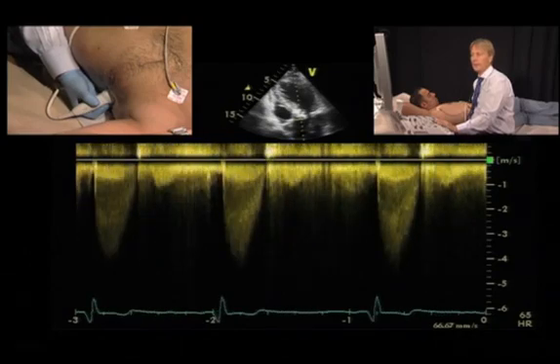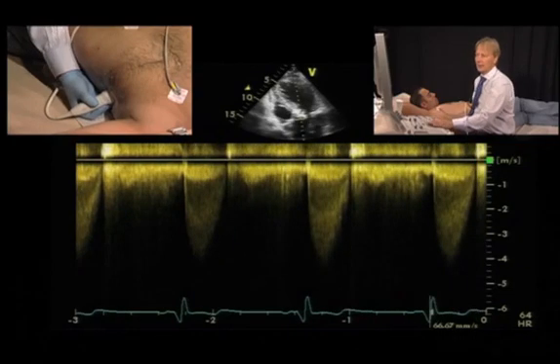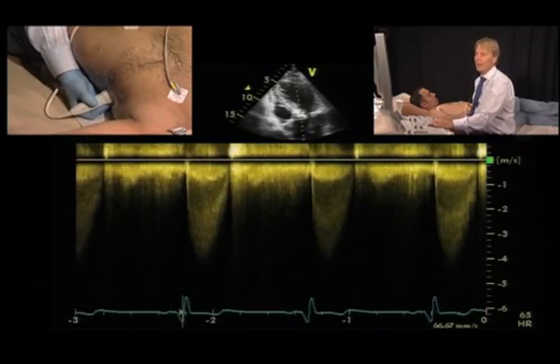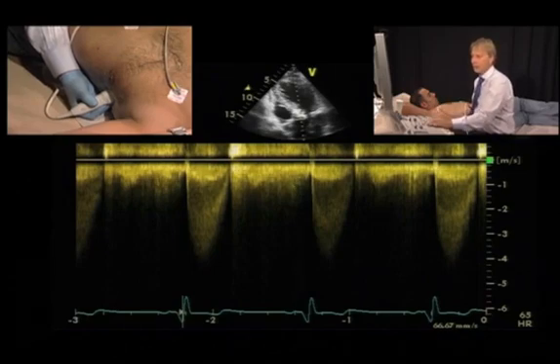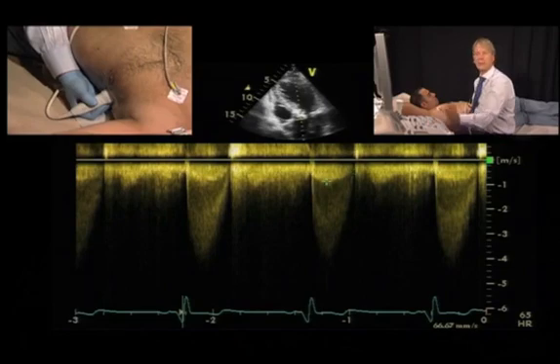From this position, wait to see if you get a beat which is high, and then measure the gradients. It's also very important to see that you get the LVOT within the curve — this confirms you have the aortic valve signal and is usually a sign that you are in an optimal position with your Doppler spectrum. Let's look at what we can actually do with the acquired tracing and what information it gives us for quantification of aortic stenosis severity.